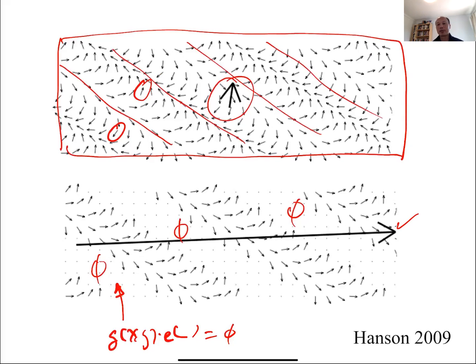Yeah, so the question is about the precession. You can imagine that these spatial patterns are MXY. So if you were imagining that, then the Z component would be pointing out of the paper. And everything here is in the rotating frame of reference.